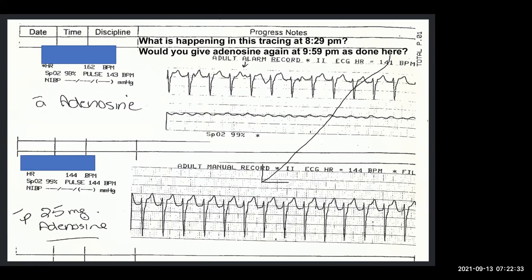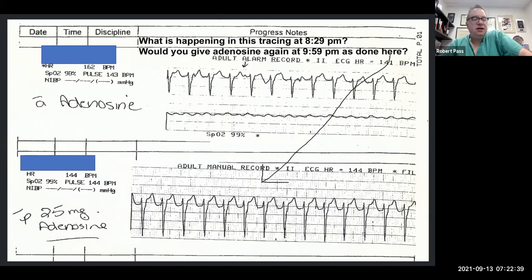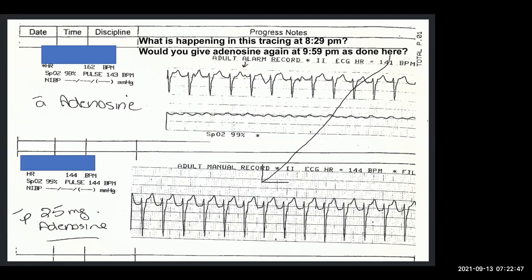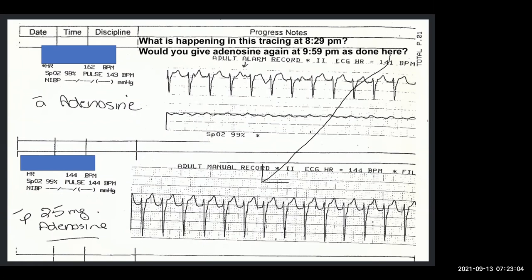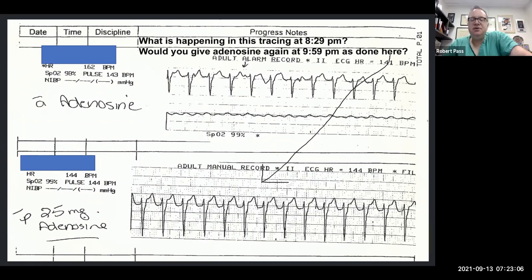Yeah, right. QRS morphology would be wider as compared to baseline. So it would compare to your baseline EKG. Right. So you would get a 12 lead in this rhythm, and you would compare it to a baseline 12 lead. And this is one of the reasons why I always say that when a patient comes back from the operating room, it's very important in the first few minutes, once the patient is stable and the nurses have done their appropriate assessments and say that they are okay with you screwing with the baby, to get a 12 lead, because you want to have a baseline to compare to the future. It's also one of the reasons why we get a 12 lead in the pre-op evaluation, so that we have a comparison for the future.